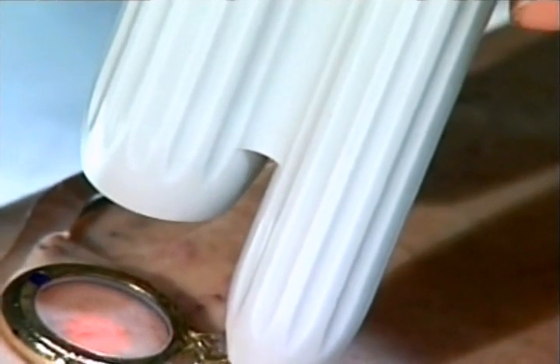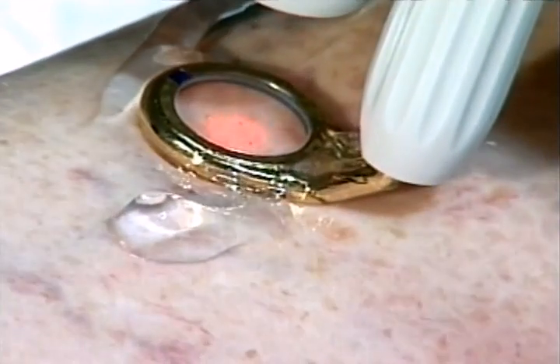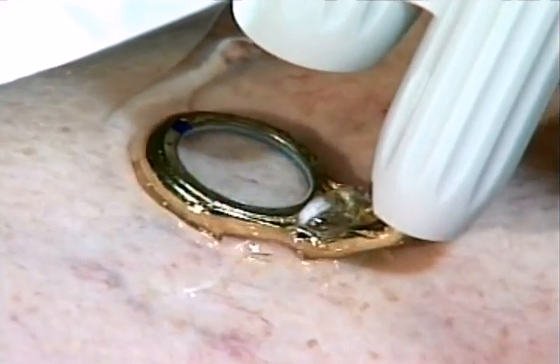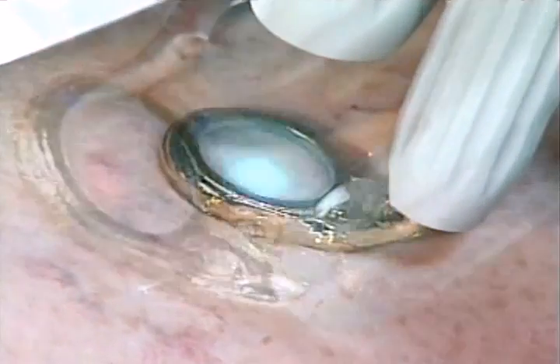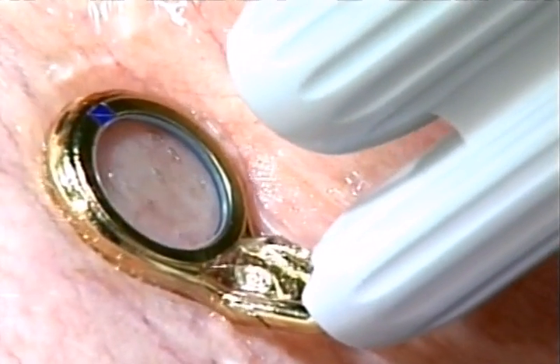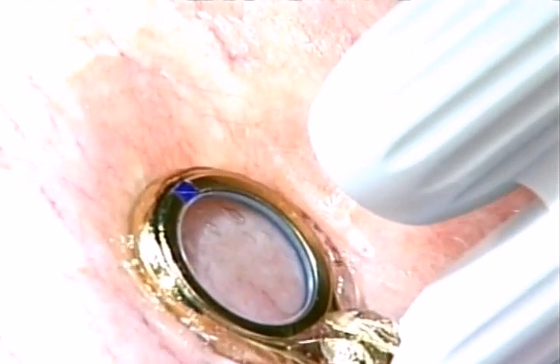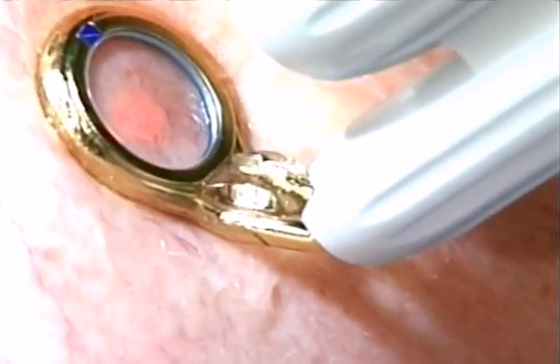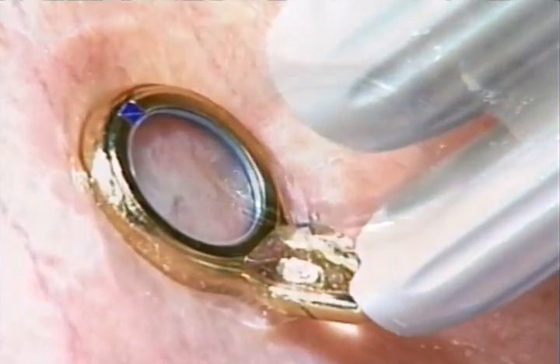And this is a larger spot. Here goes a little pulse here. And it goes pretty fast. These tend to be fairly difficult vessels. These are small ones on the legs, and it's really nice to be able to use this 2 millimeter spot. I've got everything set, and the smaller spots are a lot less painful, the patients notice.